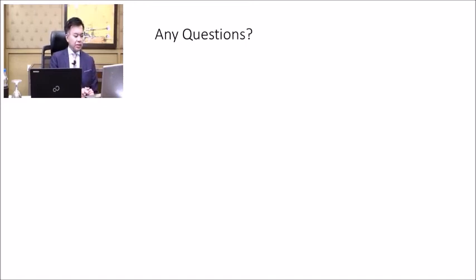Does Symphony reduce cylinder powers, or do we need to go for toric IOL implantation? The Symphony can tolerate up to 1 diopter of astigmatism, and that's fine for distance vision, but that can compromise near vision. So I prefer, in my own practice, to use the toric lens as much as possible to ensure that there's less than 0.75 diopters of astigmatism in my patients.